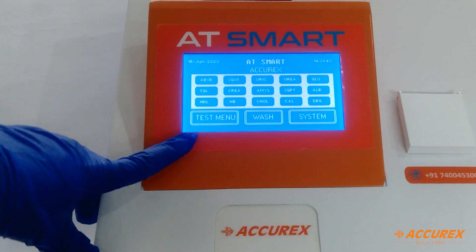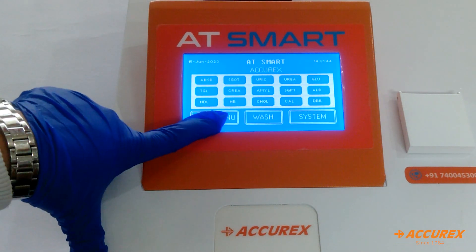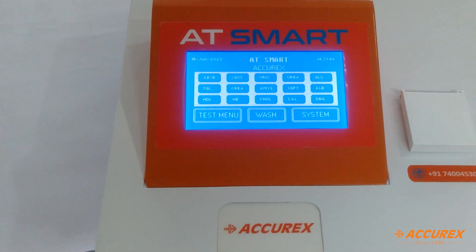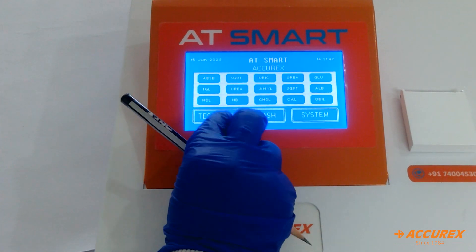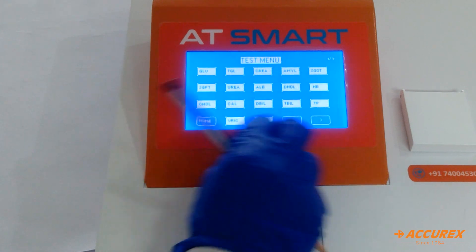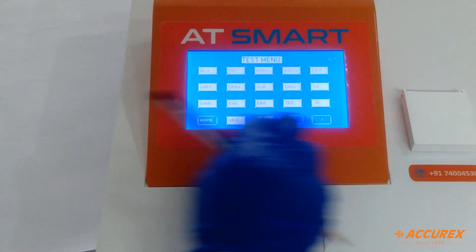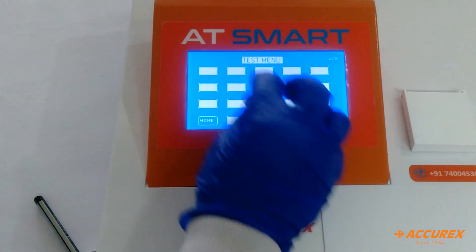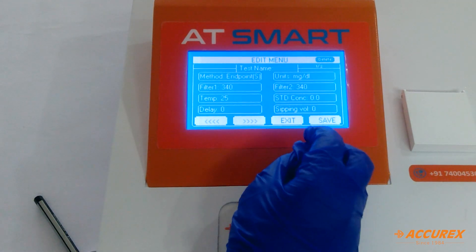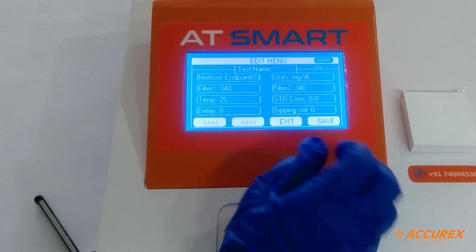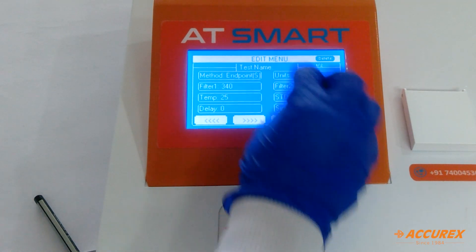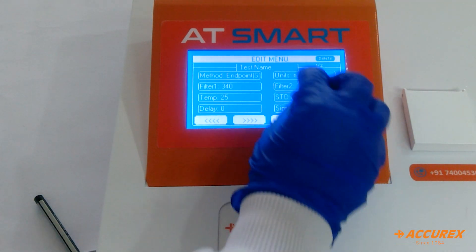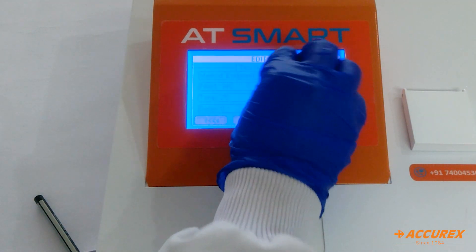From the main menu of this instrument, we have to press test menu and go to any blank test. First thing is test menu. We are making a glucose test — glucose programming. Press glucose.